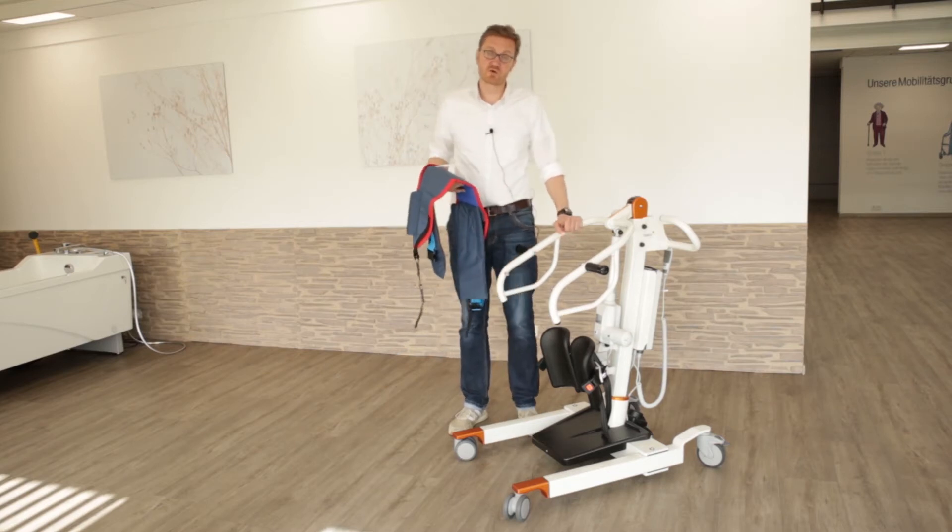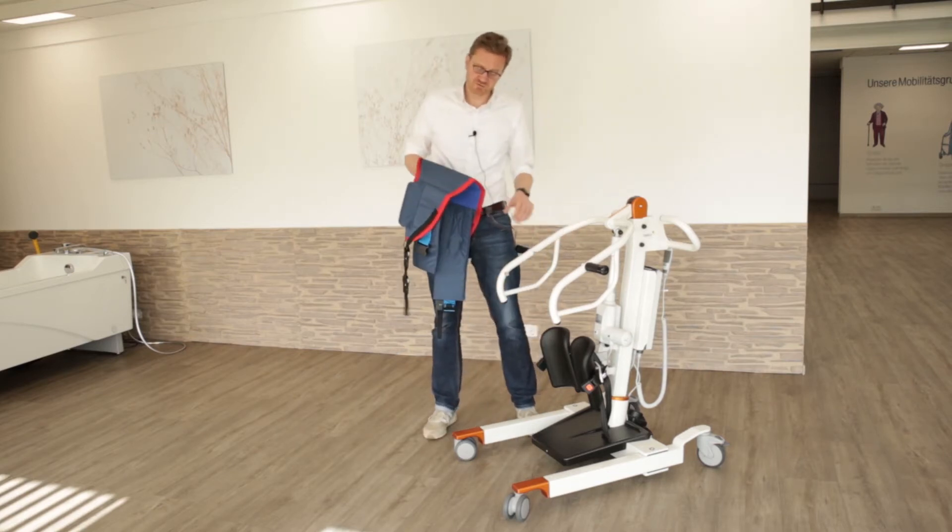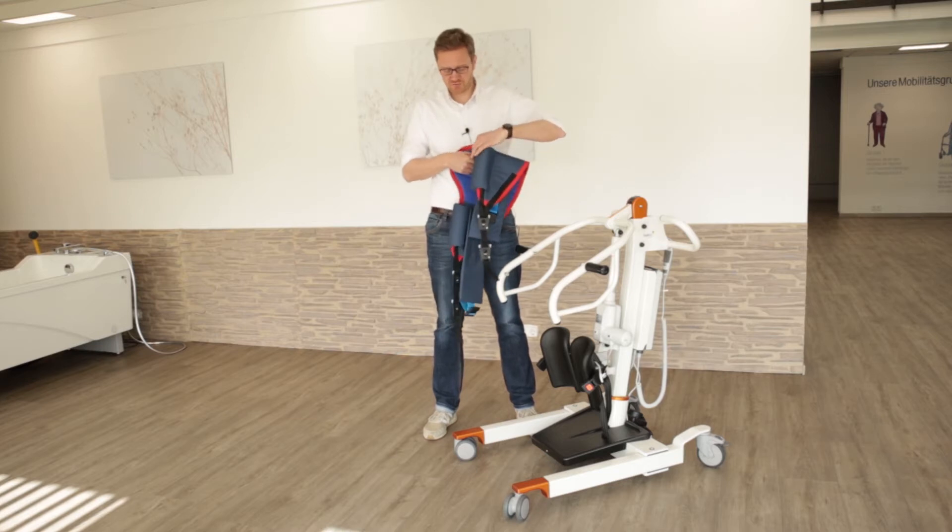Hello, my name is Matthias Tomczak. I'm the product manager of PicoHospitec. And today I would like to show you our Nora Sling.